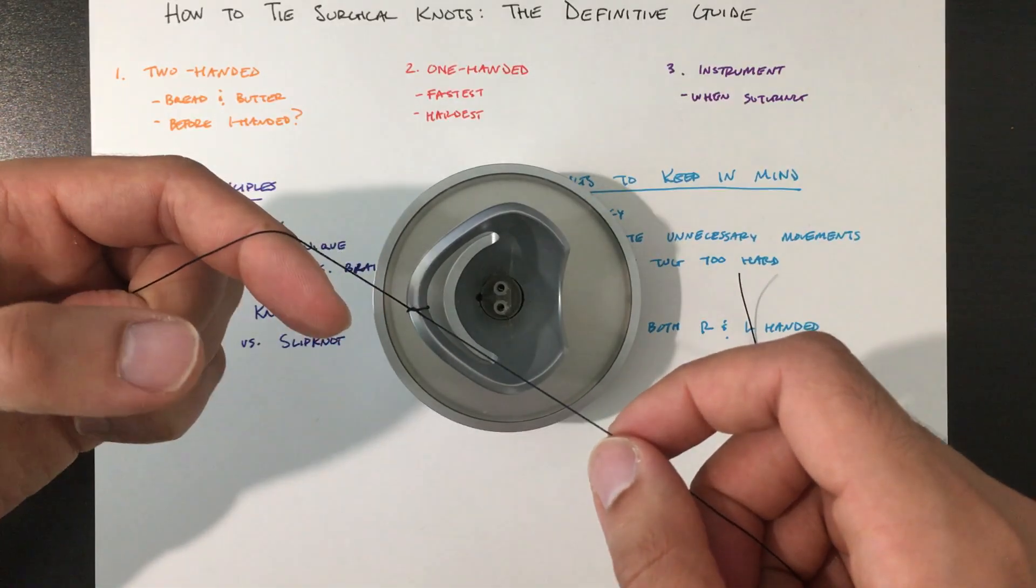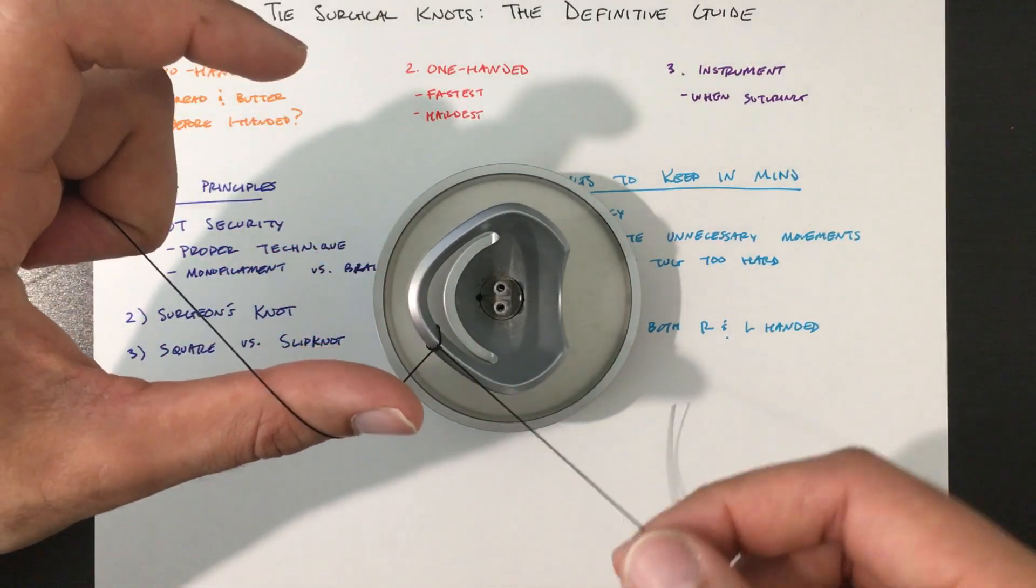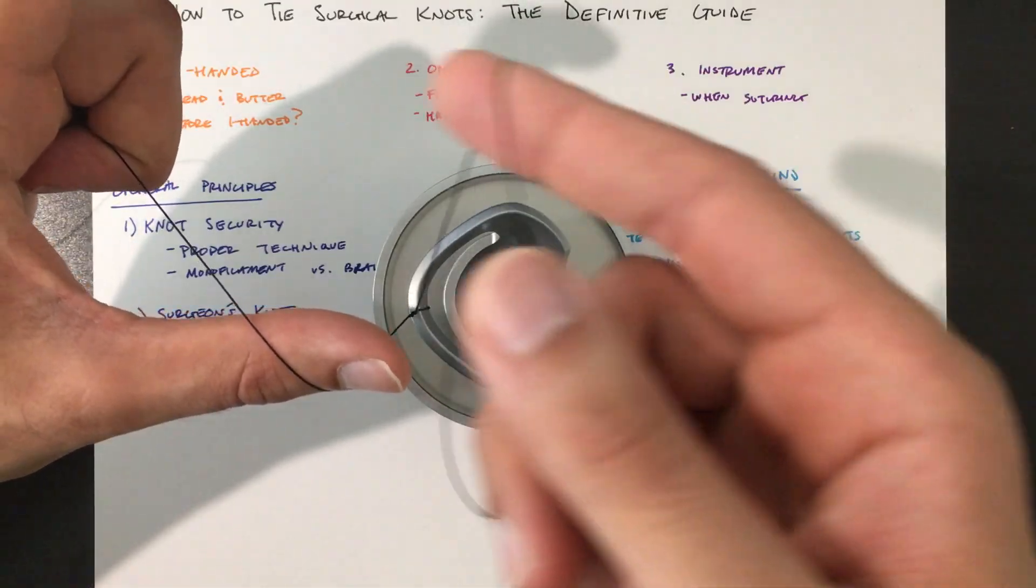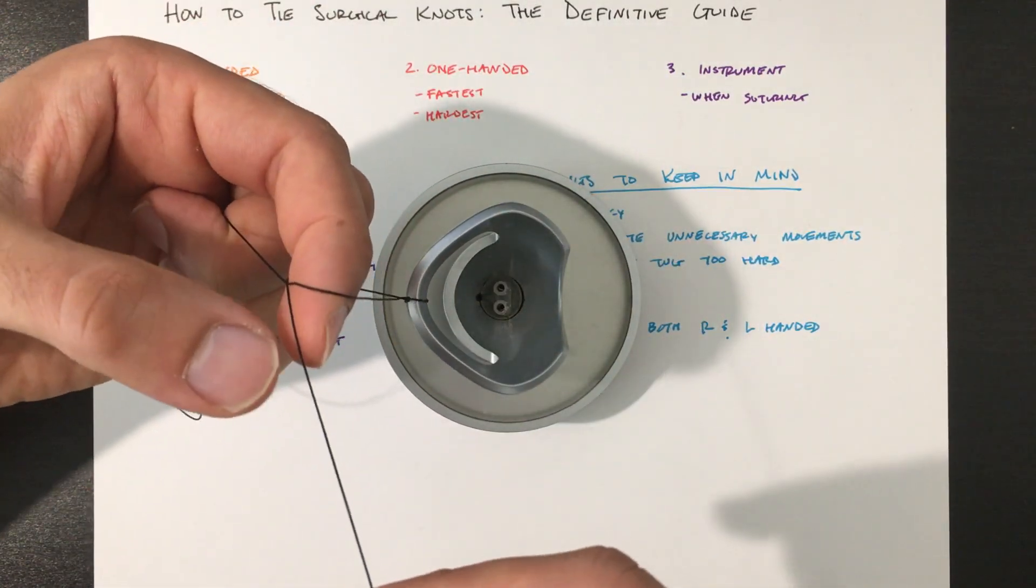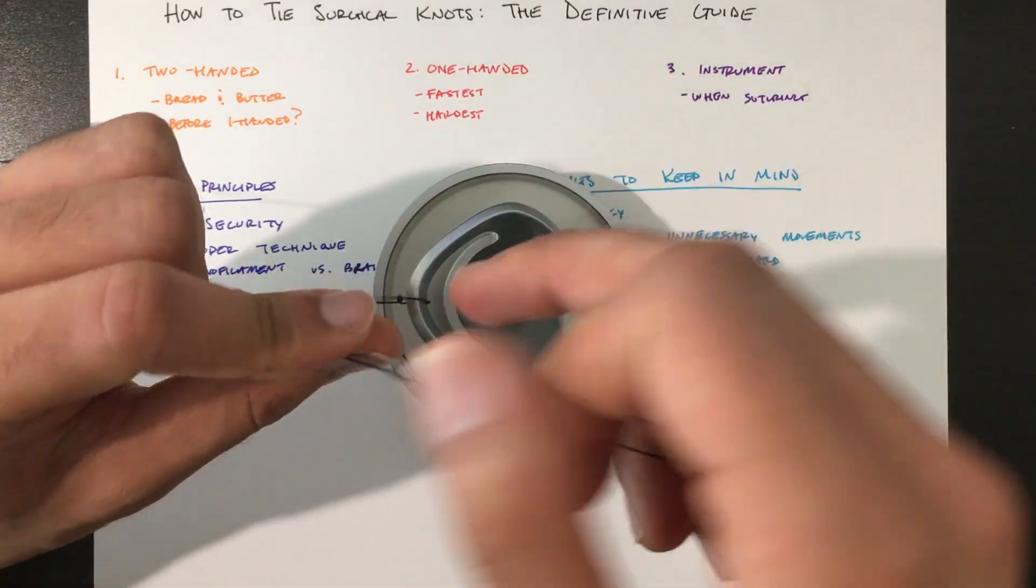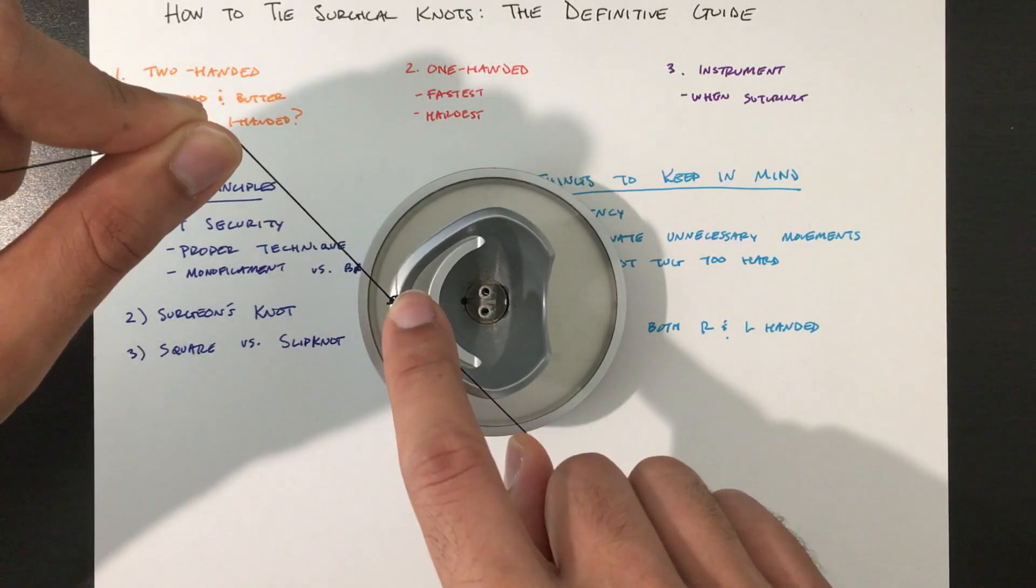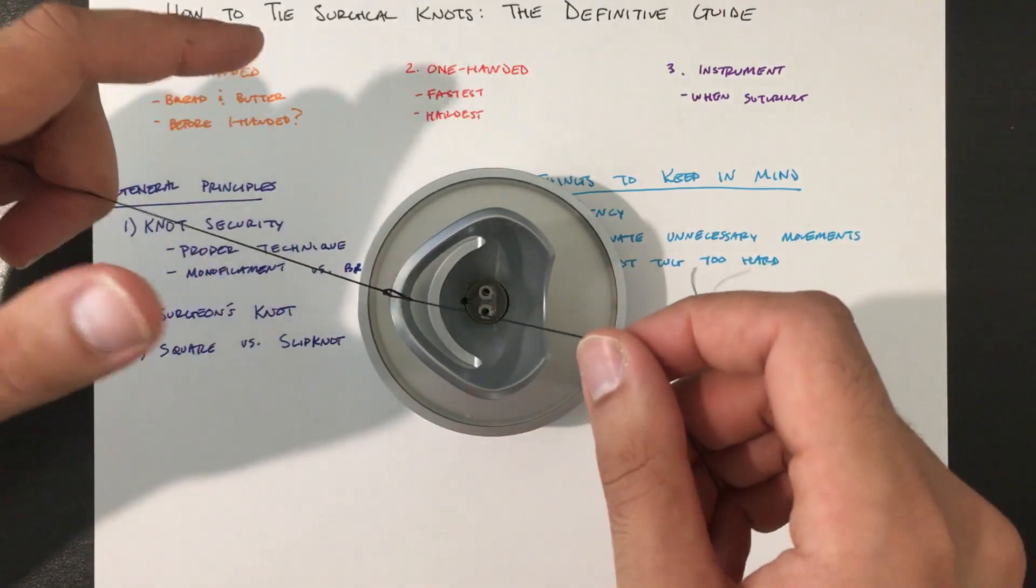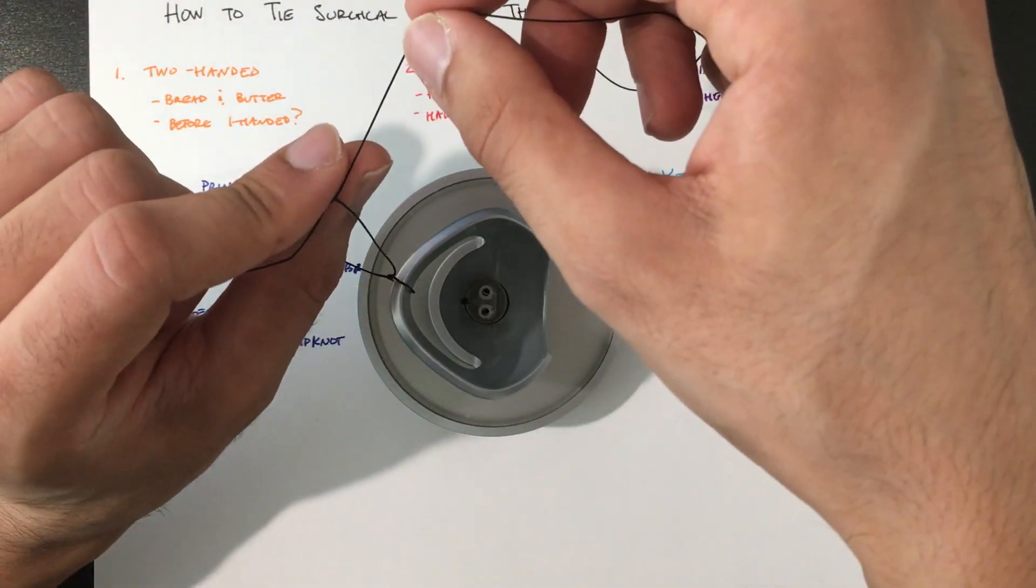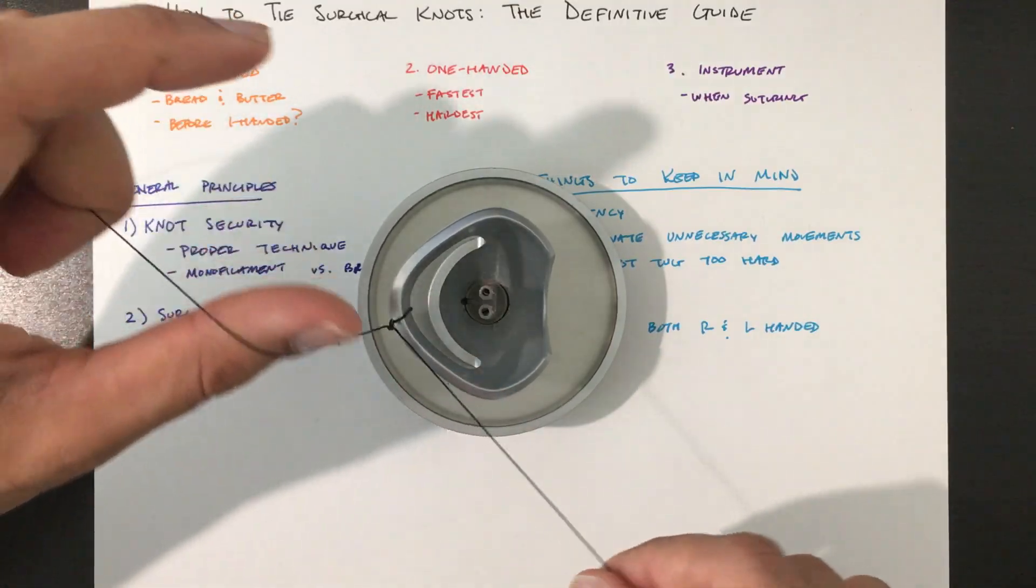So next you need to throw the opposite direction throw. So now do the same thing but with your thumb. So instead of over your index, we're going to put it over your thumb. Again, pass this in the opposite direction. Make a loop. Pinch, bring it back. Now when you're actually laying down these ties, push down with your index finger so that's going to prevent air knots from forming. Again, index. Pinch, bring it back. And then one more side with the thumb.